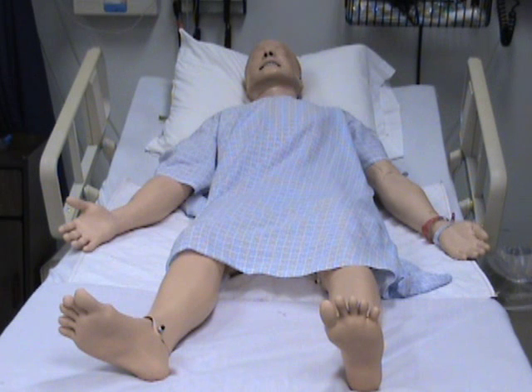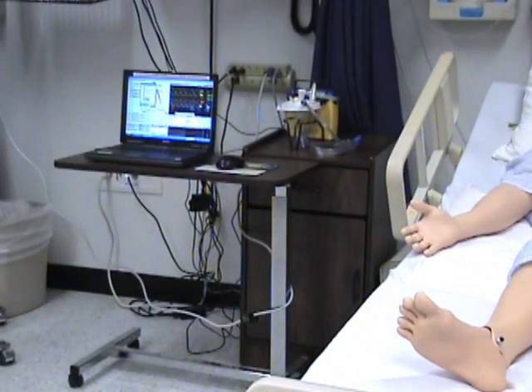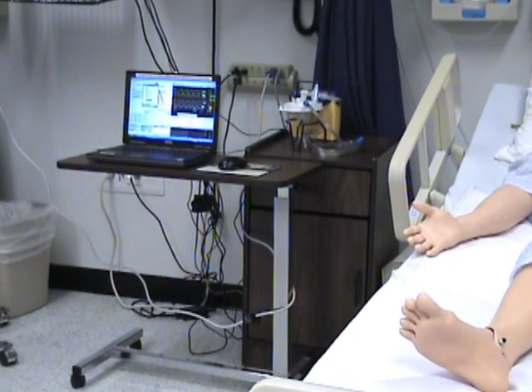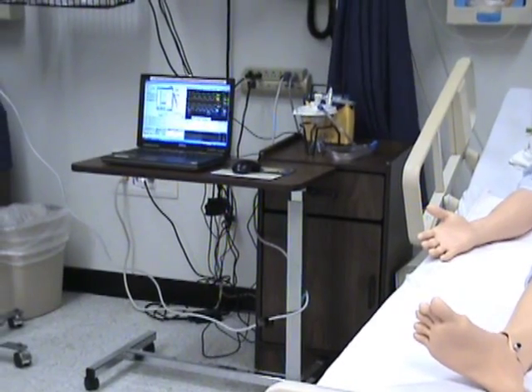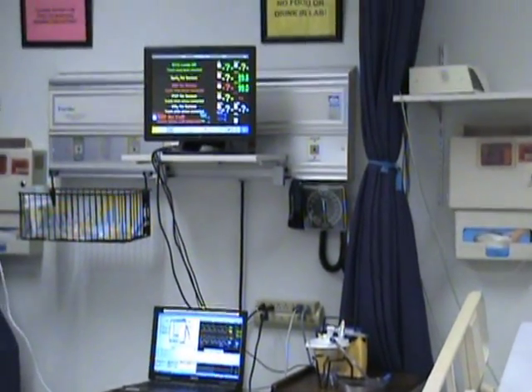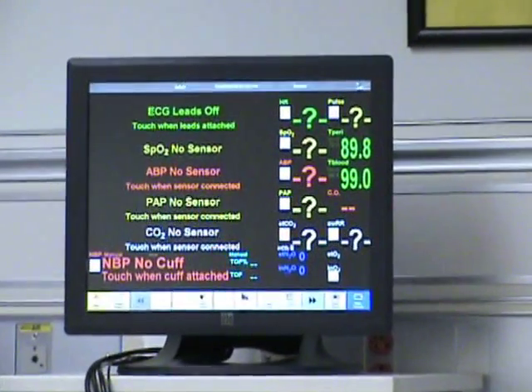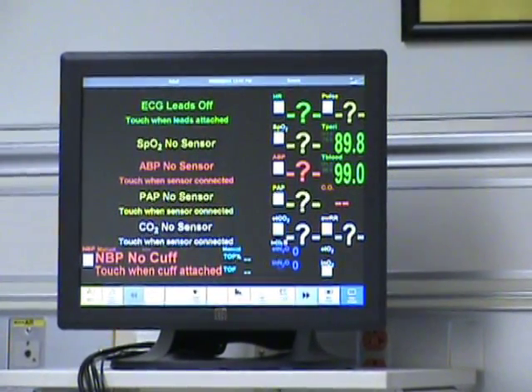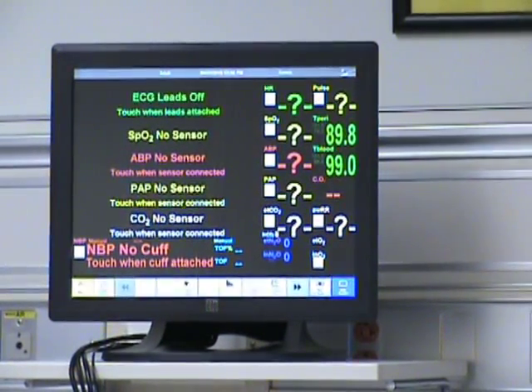helps with clinical training. He is a full-size simulator that is operated by computer programs. The programs enable instructors to fix parameters and tailor SimMan to fit specific scenarios. SimMan is able to sense chest compressions, pulse checking, ventilation, and defibrillation. A computer operator has the ability to control his responses or to pre-program his reactions.